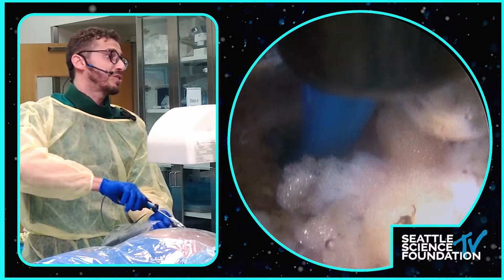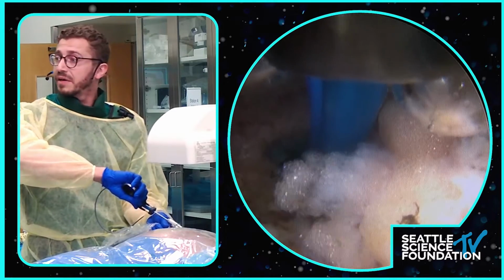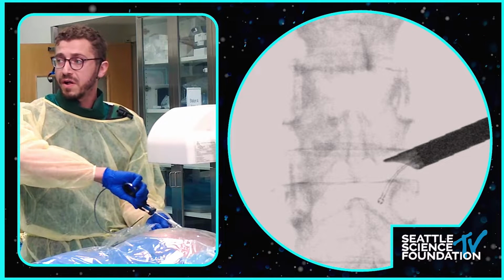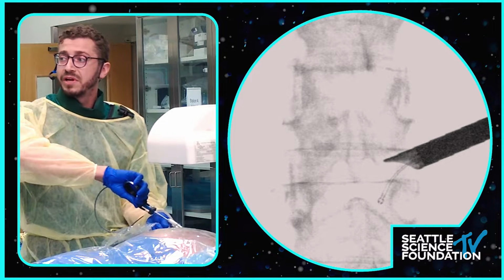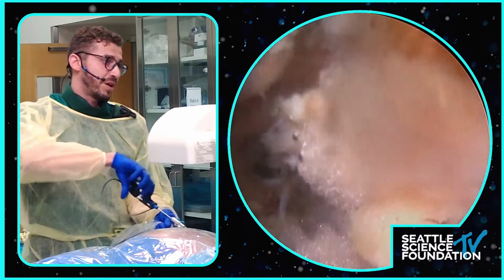And if you want to check that, you just take an x-ray. Can I have an x-ray here, please? And you'll see that we're hugging the pedicle here. Perfect. See how low we are? Again, with doing no work at all, we're already at the level of the bottom part of the pedicle. So let's expose the traversing root here.